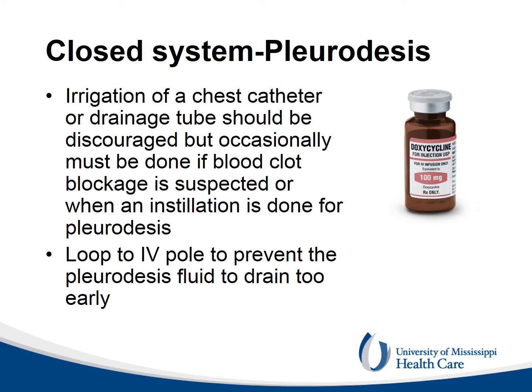The chest tube and the collecting chamber are a closed system to preserve sterility. Occasionally, under strict sterile conditions, a chest tube can be disconnected from the drainage system to aspirate clots, or a needle can be inserted on the wall of the tube, cleaned with chlorhexidine, to inject sclerosing agent and lidocaine for the purpose of obtaining pleurodesis.